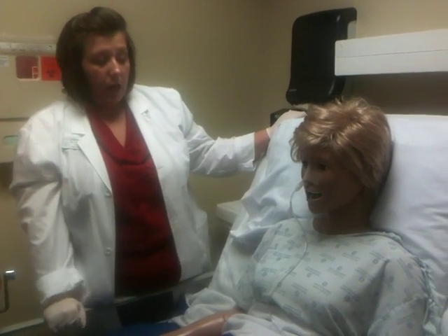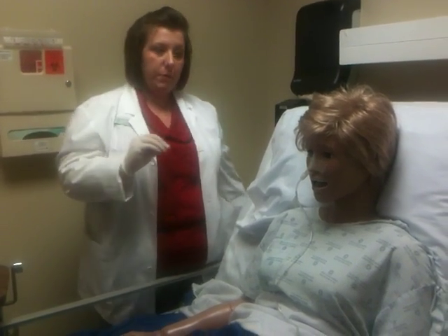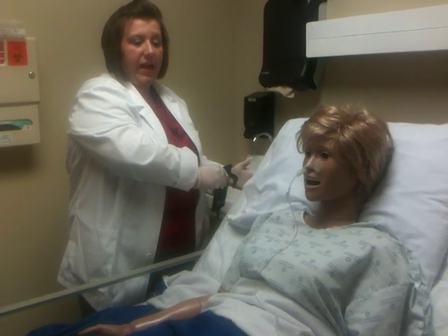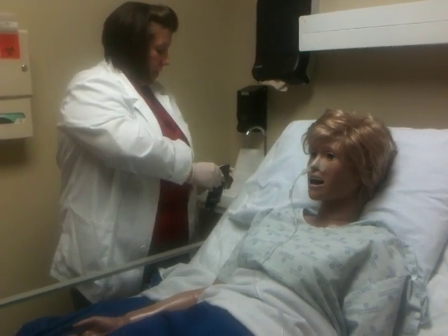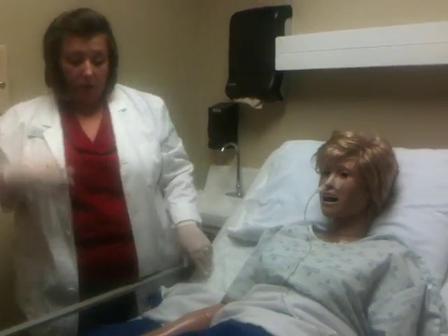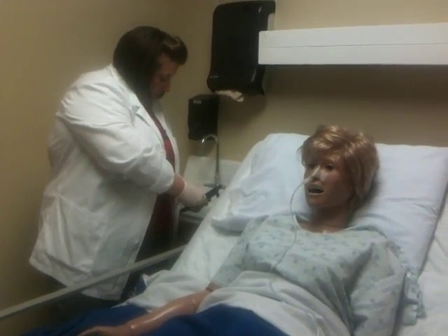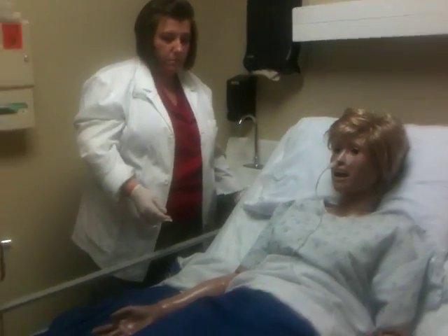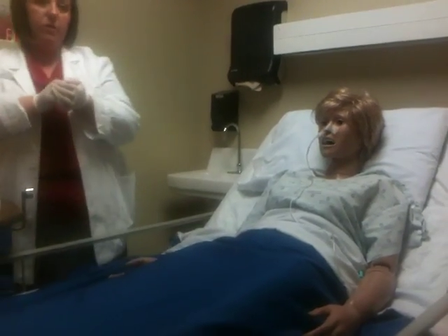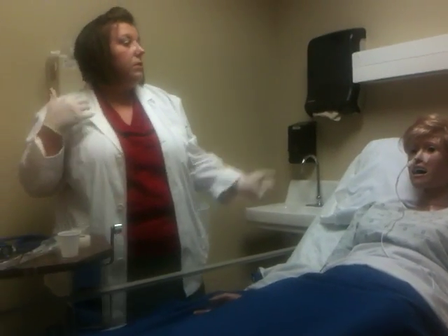Okay? So once I'm done with that procedure, I would put her in a comfortable position. Generally, when they have an NG tube, you don't want to drop them lower than 30 degrees because of that risk of aspiration. Give her call light. Lower her bed all the way down to the lowest position. And you would pull up your side rails, take off your gloves, perform your hand hygiene, and then document. Okay? So that's the insertion.